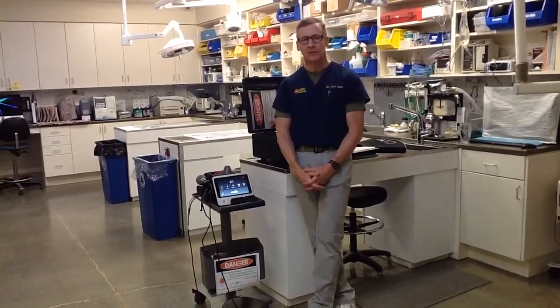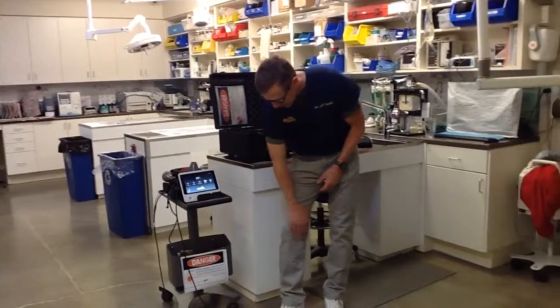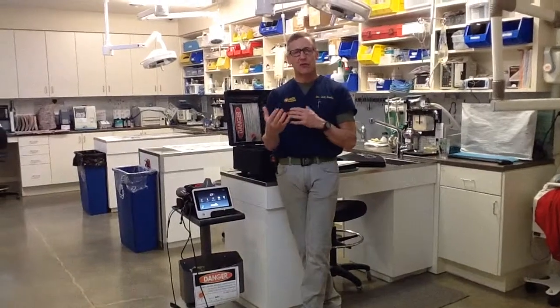It's the total number of joules administered to the specific area that we need to record and be most conscientious of — that is the dose we're giving. There are several paths to the same answer in the software. For example, fracture and arthritis settings are both deep pathologies treated at about ten joules per square centimeter. Dermatitis and otitis are both superficial, so you get a similar dose for a similar area for either condition. The software tries to give you the easiest path to an answer as possible.